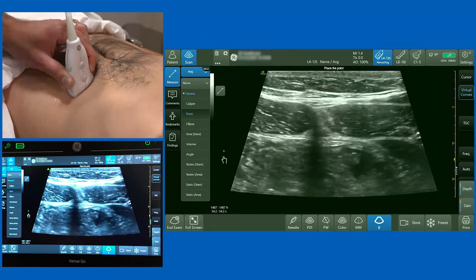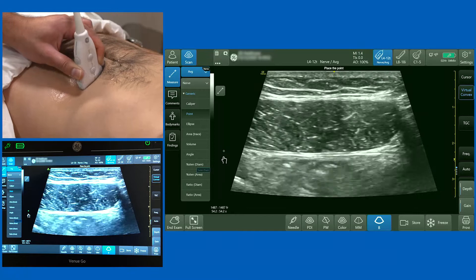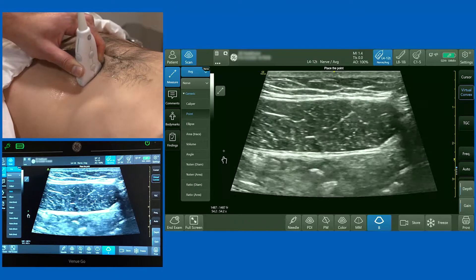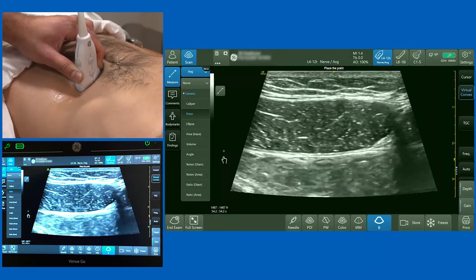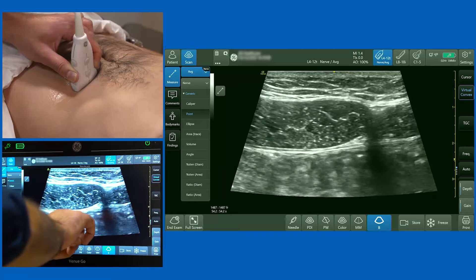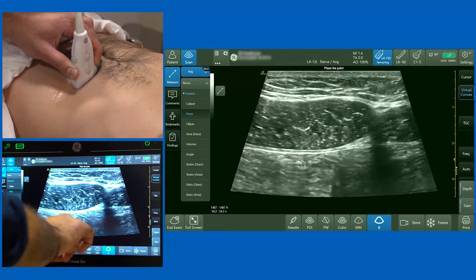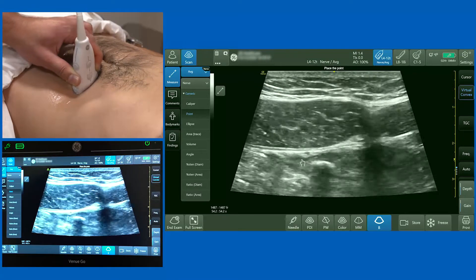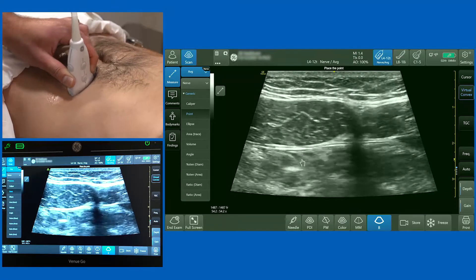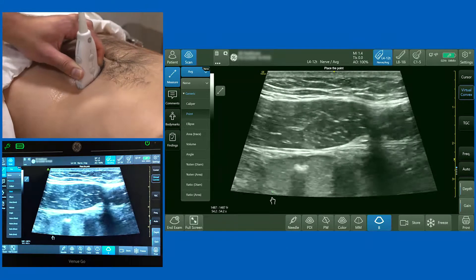I'm going to slide the probe even more towards the midline and now I'm scanning over the body of the rectus abdominis muscle. Directing the probe straight down, you can appreciate the typical muscle appearance of the rectus abdominis. Deep to the muscle there are two white lines visible on the screen: the first is the posterior rectus sheath, and deep to that is the transversalis fascia and the peritoneum together — a very obvious posterior border of the muscle.